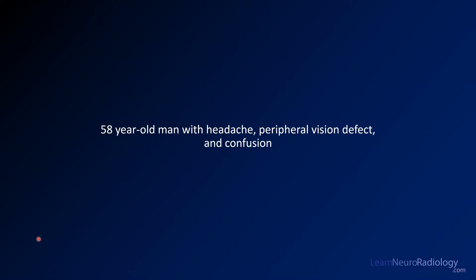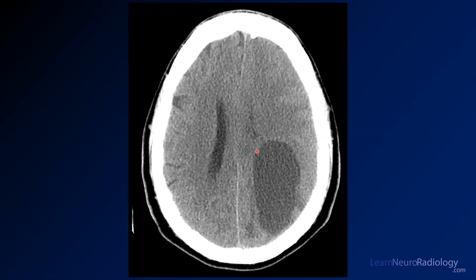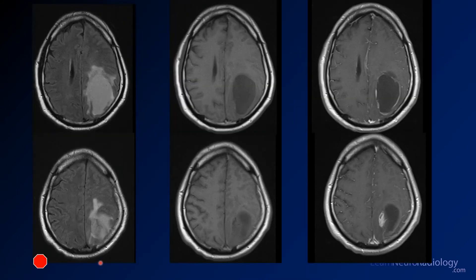Here we have a 58-year-old man with headache, peripheral visual defects, and confusion. CT shows a low-density mass in the left cerebral hemisphere in the parietal-occipital region with deep extension and mass effect on the left lateral ventricle. On MRI, FLAIR images show a pretty homogeneous lesion with a little surrounding edema. Pre-contrast shows a central region that is cystic with more solid components along the side. Post-contrast confirms a thin wall of enhancement with a more nodular area along the medial aspect — a cyst-and-nodule lesion.